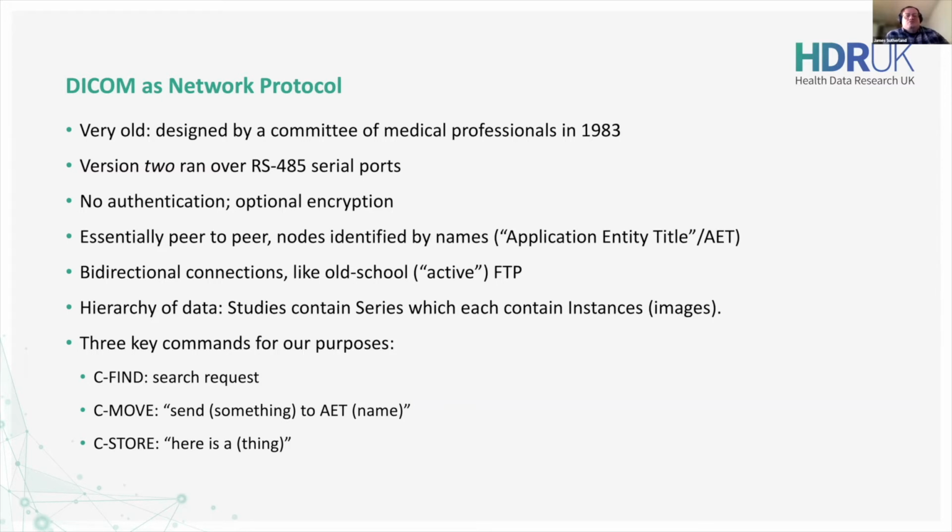Within DICOM, I probably mentioned this earlier, there's a hierarchy. So you have a study, which will often be a group of scans that are related in some way. You might, for example, have both a PET scan of somebody with cancer, which highlights tumor activity, and an MRI scan of the tissue the tumor is in. The MRI scan, for example, is a series, which might consist of 64 or 128 separate slices, each of which is an instance or image. So you group that into a series, which is the scan, and then you could combine those two series together into a single study, which is your cancer scan on a particular date.